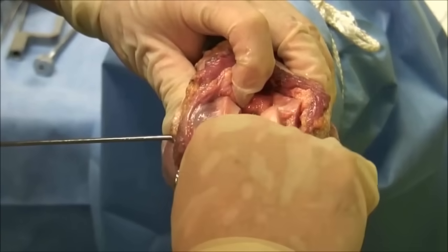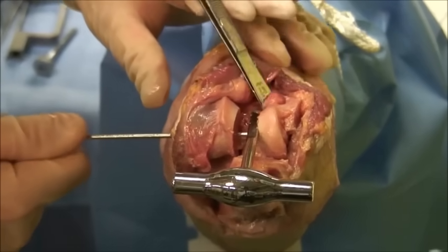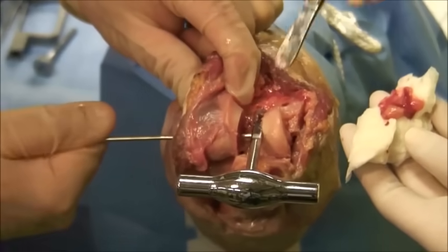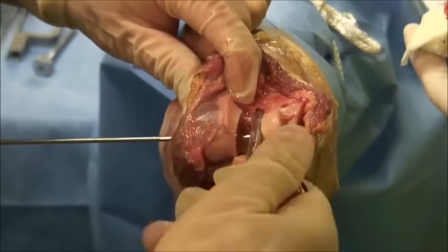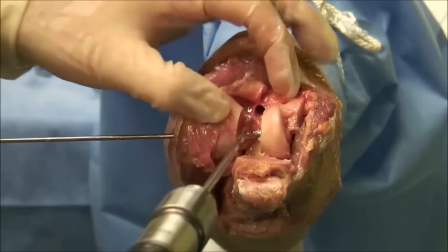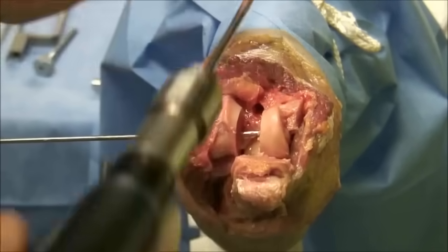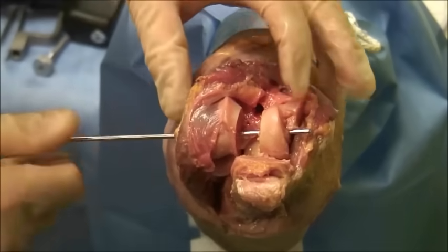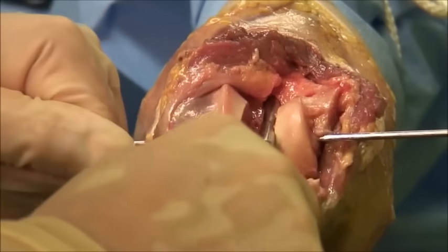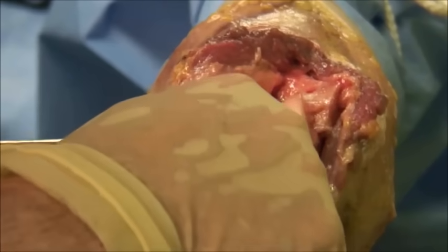The entrance to the humeral medullary canal is manually performed. Using a small drill it can be elaborated, and using a probe the posterior-anterior offset is then determined.